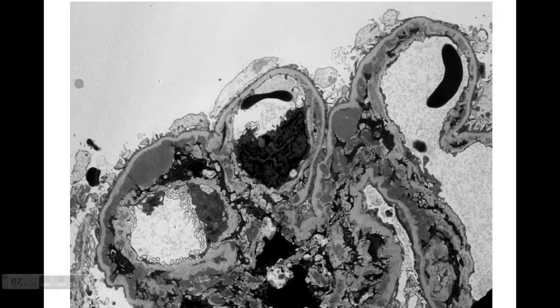deposits. And here you have, for example, this is original basal membrane here. This is a subendothelial deposit. This is a new basal membrane over here. And similar here, you have subendothelial deposit with two basal membranes on each side. So that is really your typical MPGN with the deposits.